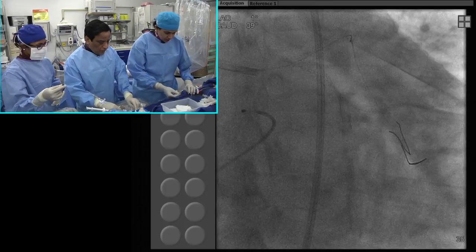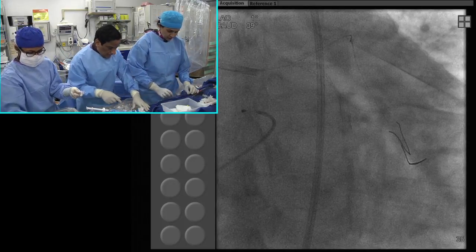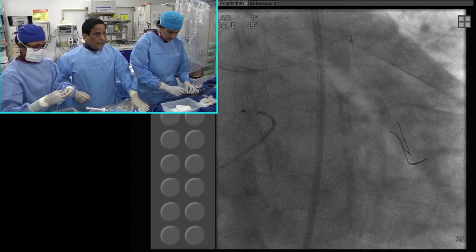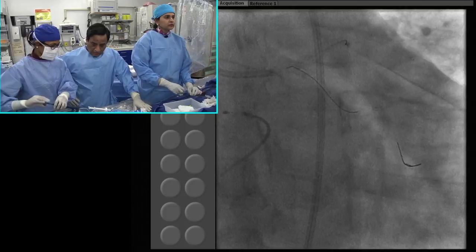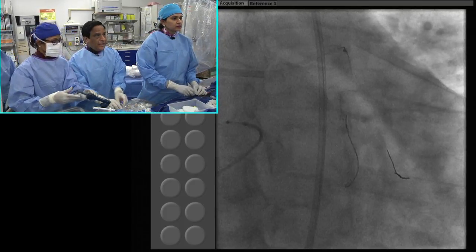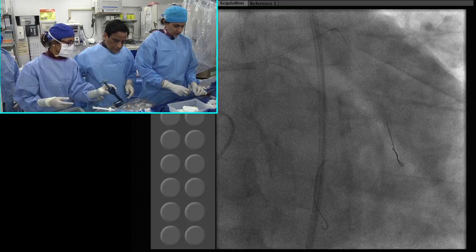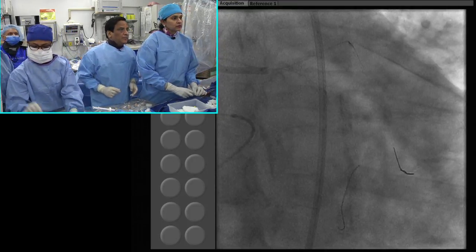Now for this patient, of course, optimization of the left main is key in complex cases, particularly when you think there is another option. I let them come back for a 6-month angiogram, which is not routine now, but I still propagate that advice, and I do it in many of these cases.